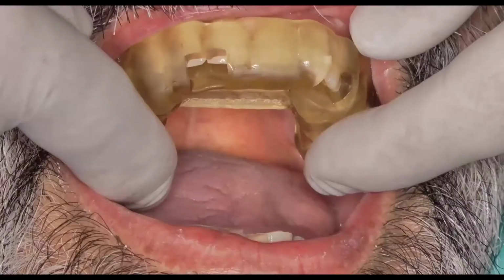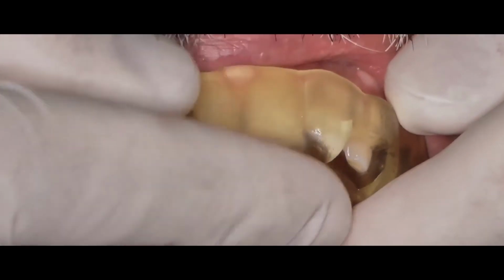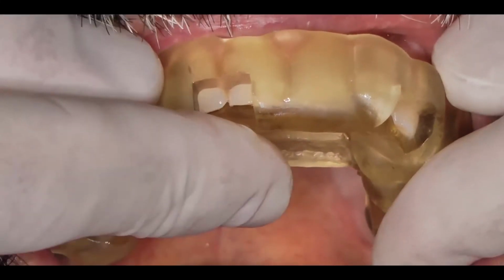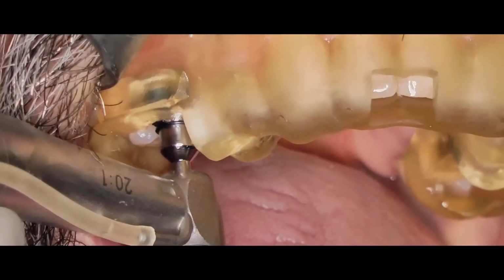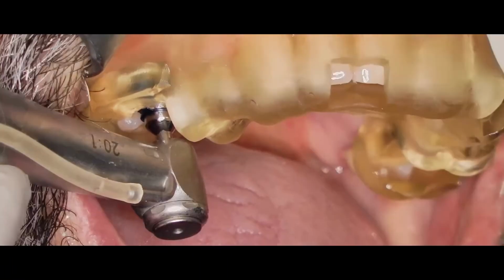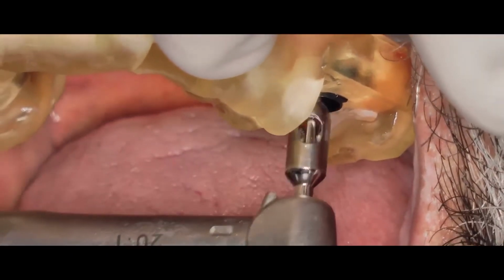So I'm checking the fit of this guide, as you can see by the windows on the guide, and the adaptation is just perfect. The first drill we should be using is this tissue punch. It is actually a very small tissue punch, very minimally invasive. Sometimes though, we need to remove the guide to ensure all soft tissue was removed, despite the expert being completely able to remove it as well. I don't use irrigation for this.